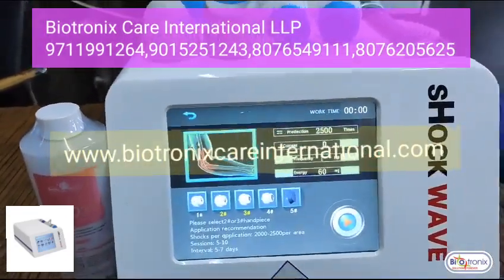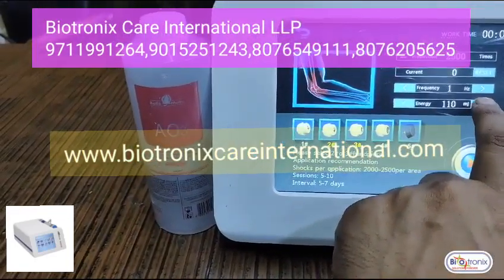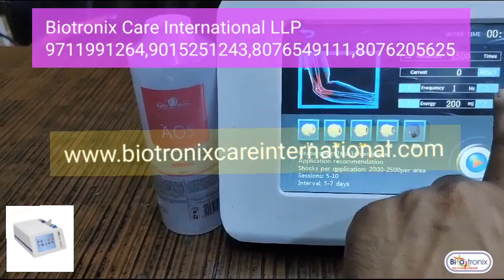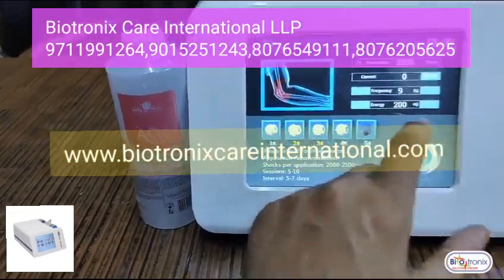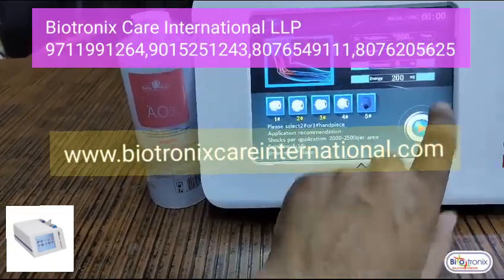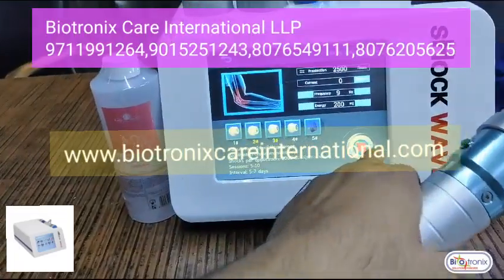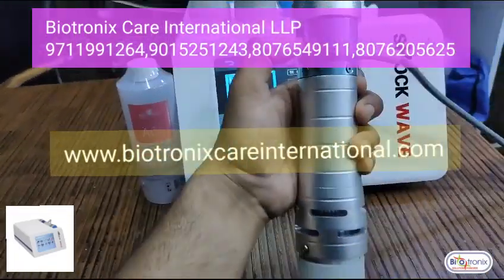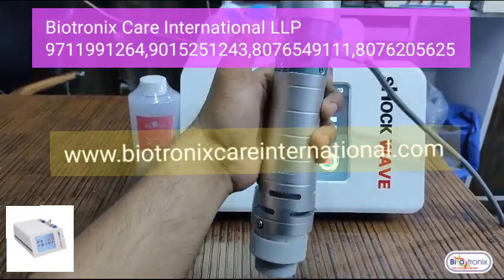Suppose you're selecting elbow. You can select the parameter like energy — you can go up to 200 millijoule — and frequency. Then you need to press the start button to switch it on.